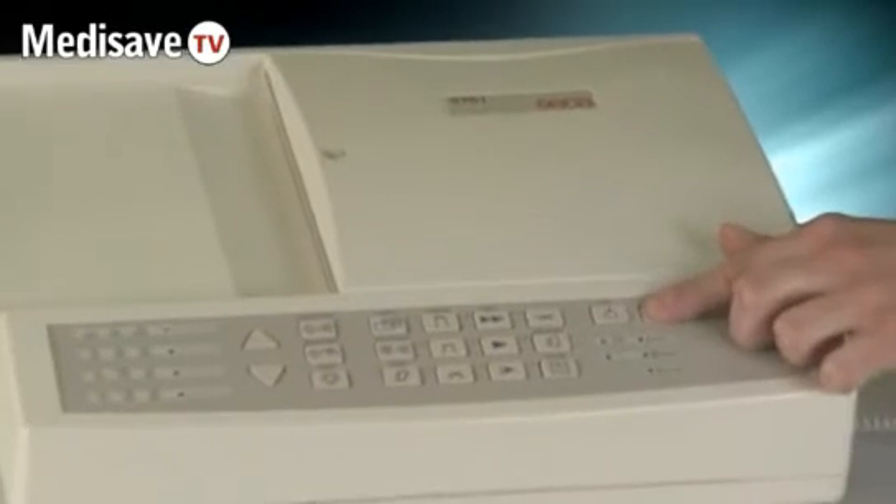The Seeker CT6i ECG machine is very straightforward and easy to use. You simply connect up to the patient in the totally normal way, then turn the machine on.